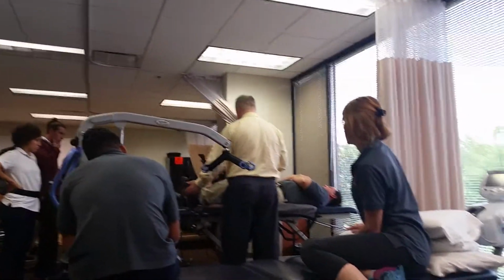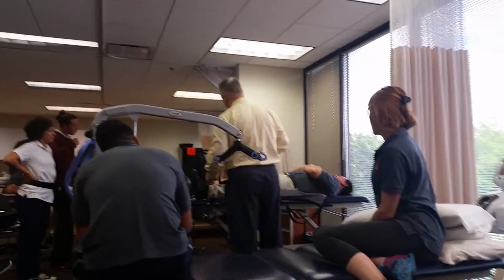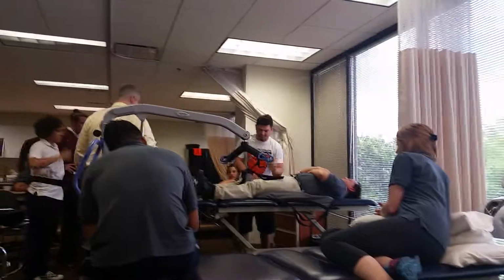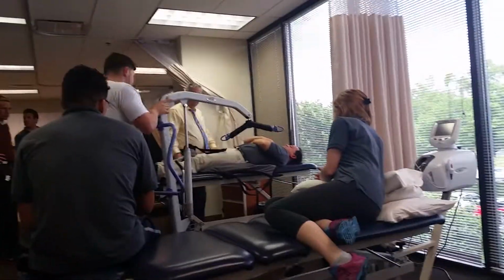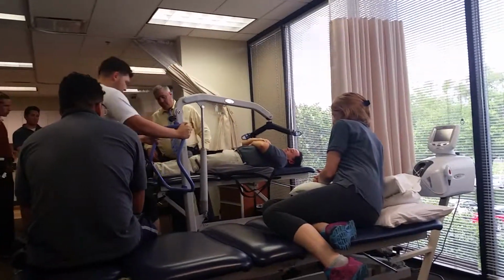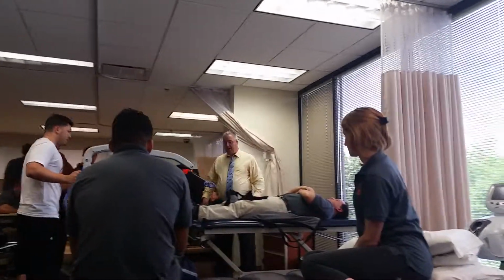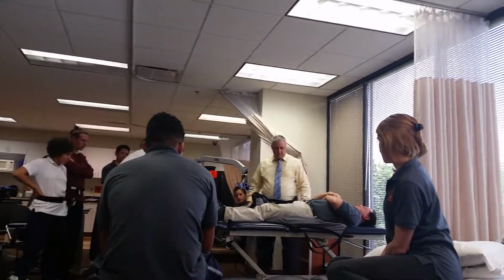So you have this here. Okay, so we need something to support the thighs when we get them up. So for better support, you just cross through the other loop. So you're gonna hang the left side on the right and the right side on the left. Okay. So Gabe's gonna go ahead and hook it up, and I'm gonna assist him. So basically, we have to open it up to bring it in here to straddle this, and this could present a bit of a problem.